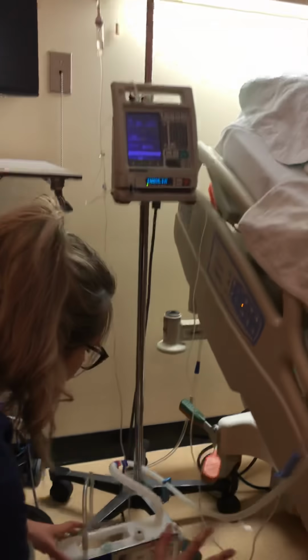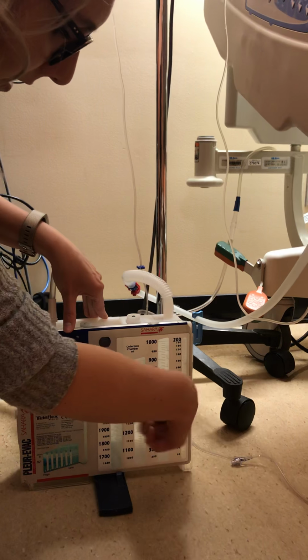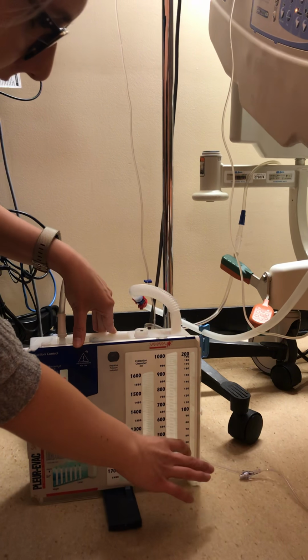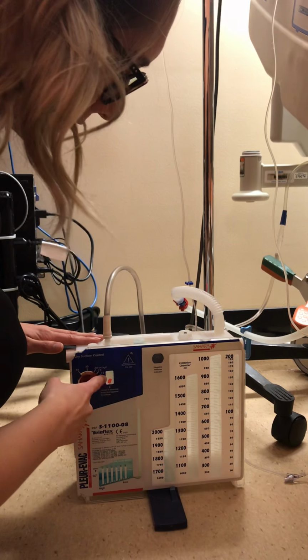Okay, so now I'll just go over the drainage system with you. So this is the drainage collection chamber. At the start of my shift, I'd take a Sharpie or a piece of tape just to indicate how much drainage is in there, noting the color of the drainage as well as the consistency, so I know how much is done by the end. The suction is on to 20 as per ordered, and I can see that it's functioning by the orange ball here.